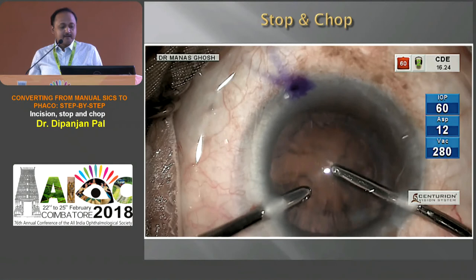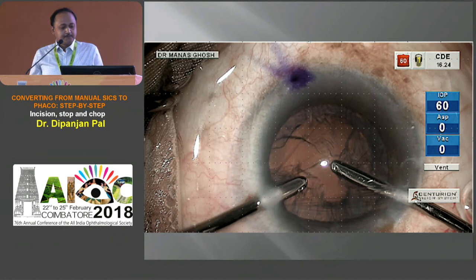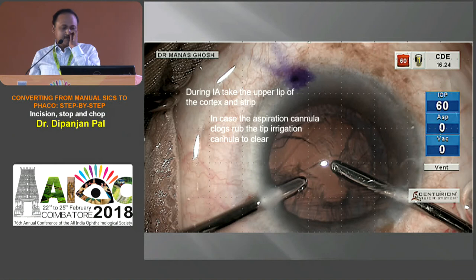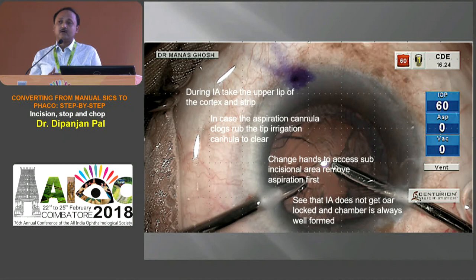For a beginner, it is always better to start with bimanual irrigation aspiration, where the irrigation port and aspiration port are separate. During this irrigation aspiration, take the upper lip of the cortex and strip. If the aspiration cannula is clogged, rub it against the irrigation cannula to clear it. You can always switch hands to access the subincisional area or the opposite pole. Make sure the IA doesn't get locked and the chamber is always well formed. This can be your first step from SICS to phaco — after SICS you can try and start with bimanual irrigation aspiration and get conversant with it, so when you are doing phaco you already know that step.